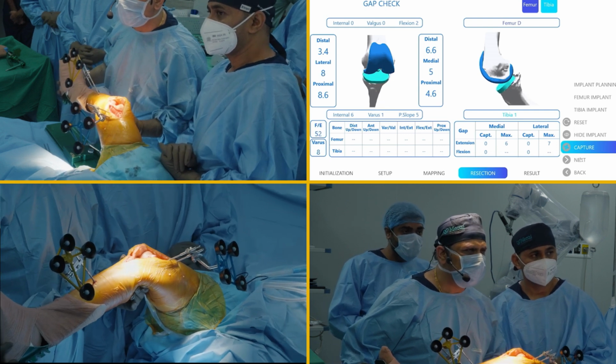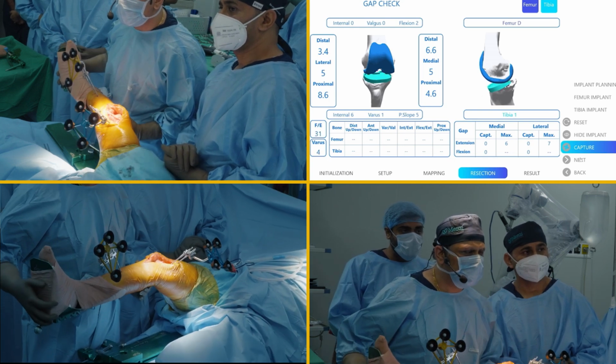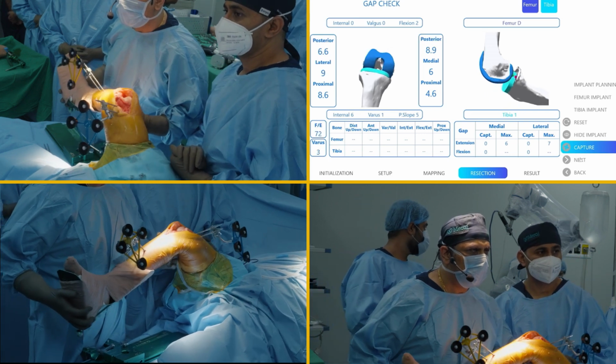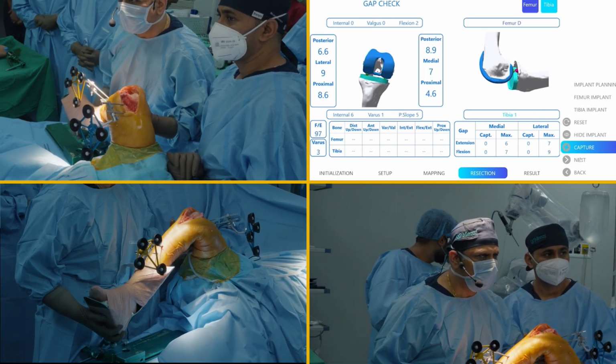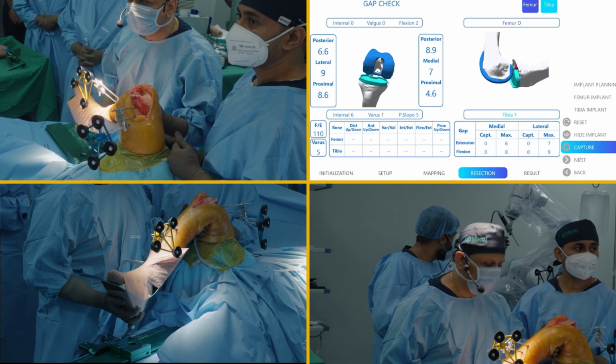Again, if you see the gaps, what was 4 and 4 or 5 and 4 in extension is becoming 5 and 5, then 8 and 6, then 9 and 7. That means my flexion is a little bit looser than extension.